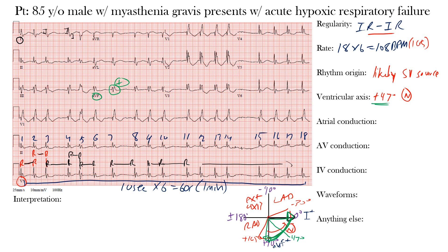Regarding atrial conduction: because we can't make out any clear P waves, and P waves represent atrial depolarization, there is no clear atrial conduction. It may be that chaotic atrial activity is going on above. So in this case we note possible chaotic atrial activity.